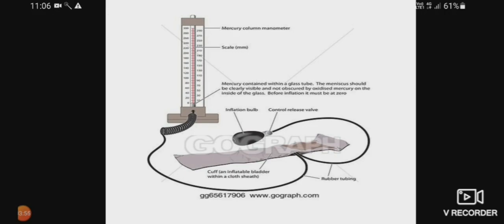Here is the diagram of the sphygmomanometer. At the top there is a mercury column manometer with a scale that records the pressure in mmHg. At the bottom there is a glass tube filled with mercury — when we apply pressure to the inflatable bag, the mercury level rises and you are able to record the blood pressure. At the bottom you will also see the inflatable bag with a cuff, rubber tubing, and a controlled release valve attached to the inflation bulb.